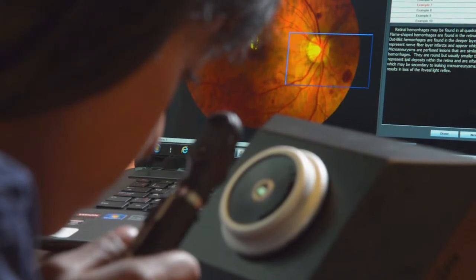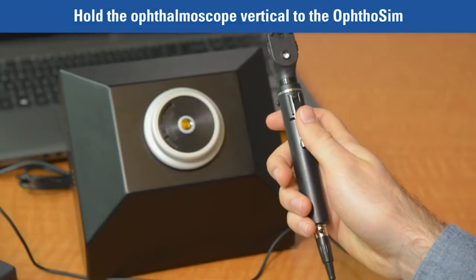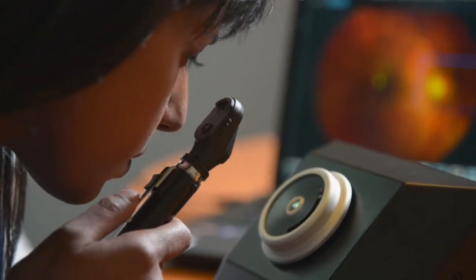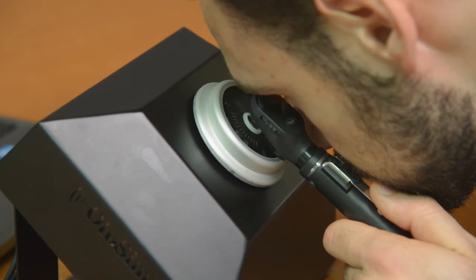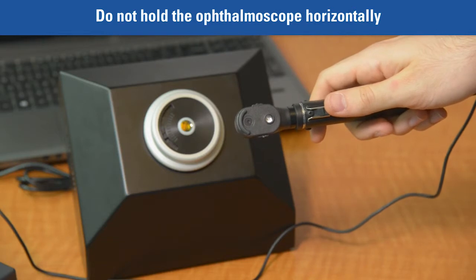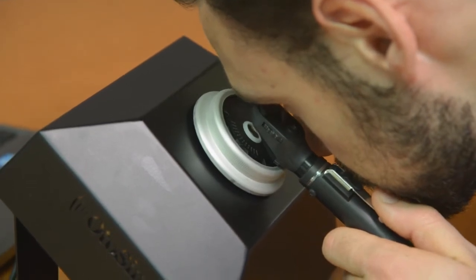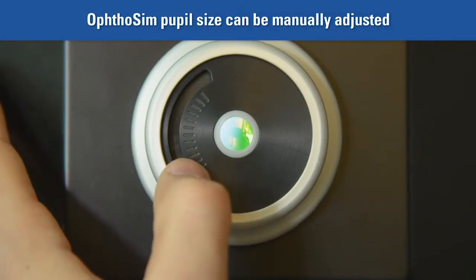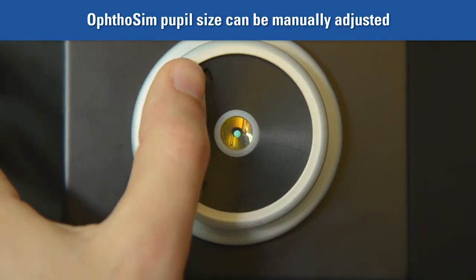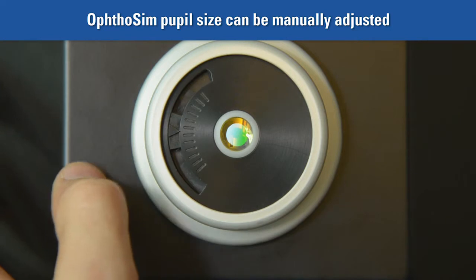Let's see how to properly use the OphtoSim ophthalmoscope. Holding the ophthalmoscope properly is a must — hold it vertical to the OphtoSim when in use. This ensures the most accurate motion tracking and is also consistent with medical best practices. The unit will not function correctly if you hold the ophthalmoscope sideways. Note that it is also common practice to hold the ophthalmoscope in the same hand as the eye you're examining. For training purposes, you can manually adjust the size of the pupil using the dial on the side of the eyepiece to either dilate or constrict the pupil size.